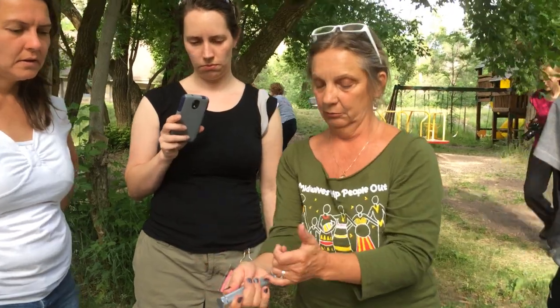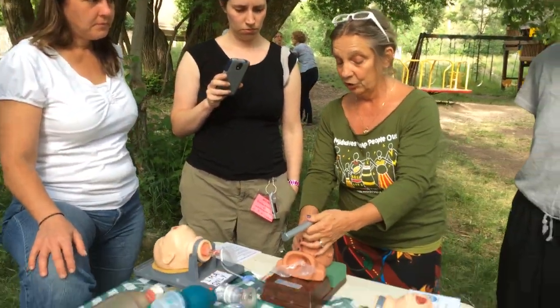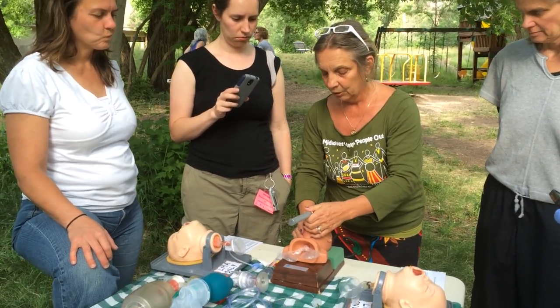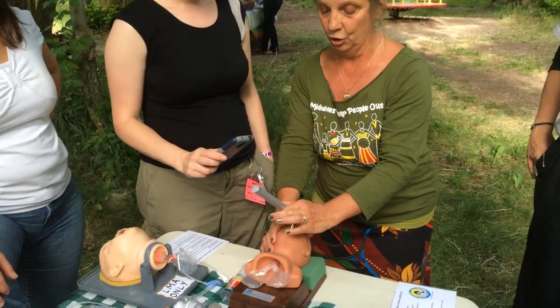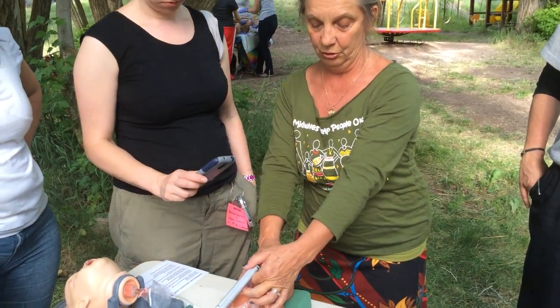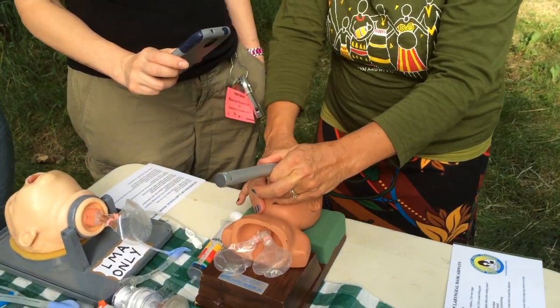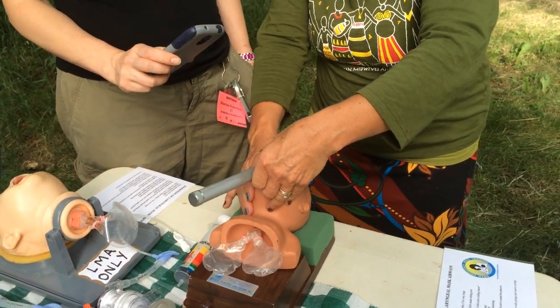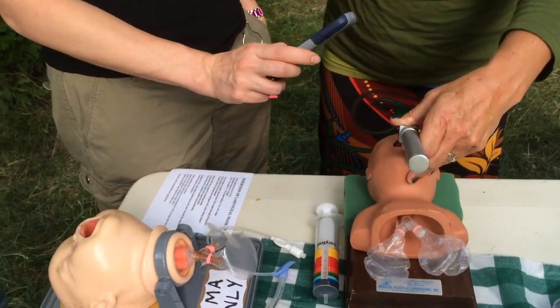So this one, A, you have to have all the equipment. B, you have to feel comfortable putting something hard and pokey into a baby. You go all the way to the back of the baby's tongue and lift up. No pressure front, no pressure below. Just lifting up on the baby's tongue. Then you anchor your hands here. And you're noticing that I'm using my non-dominant hand. This is my dominant hand.